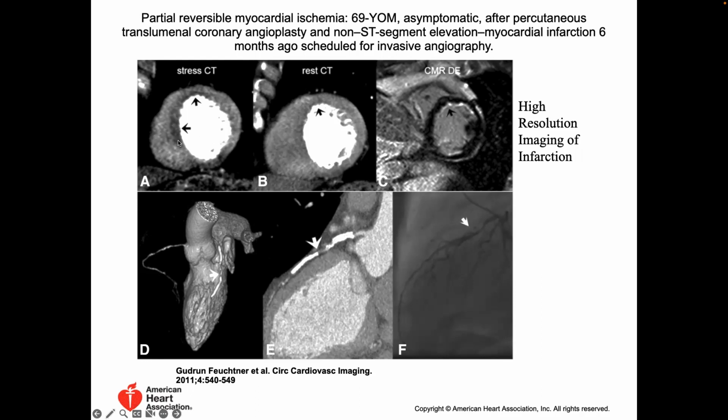This is saying I've got low perfusion, but it's not dead, which is good. That means if we intervene and open up that vessel, the tissue downstream is viable. It'll probably just recover to normal function. It's not dead yet. I'm not dead yet.